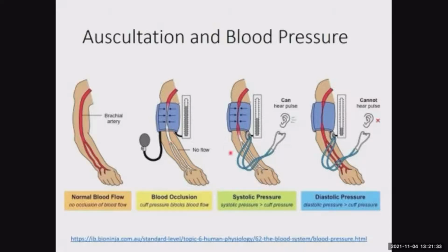As we go over here to that range between the systolic pressure, when the heart is contracting, and the diastolic pressure, when the heart is relaxing, during the heart contraction we're going to increase the pressure within our arterial system, increasing the pressure pushing back against our blood pressure cuff, and we're going to be able to squeeze through a little bit of blood at those higher systolic pressures during the cardiac muscle contraction. So what we're going to hear are little bursts of sound that are called the Korotkoff sounds.